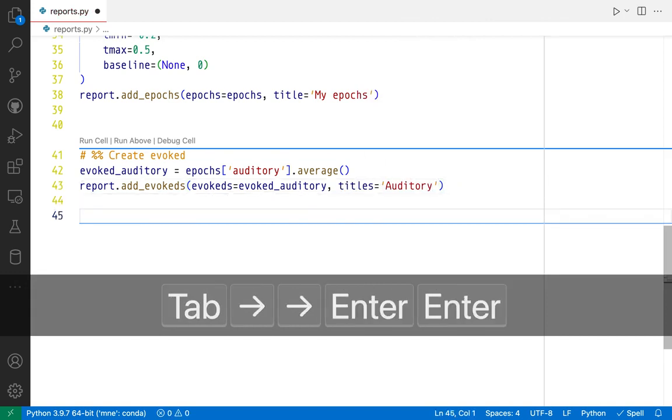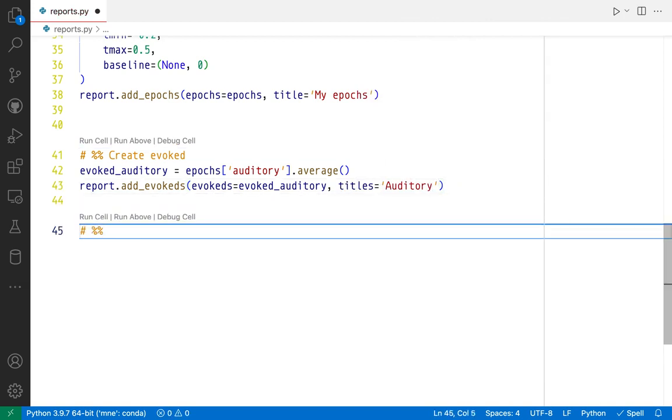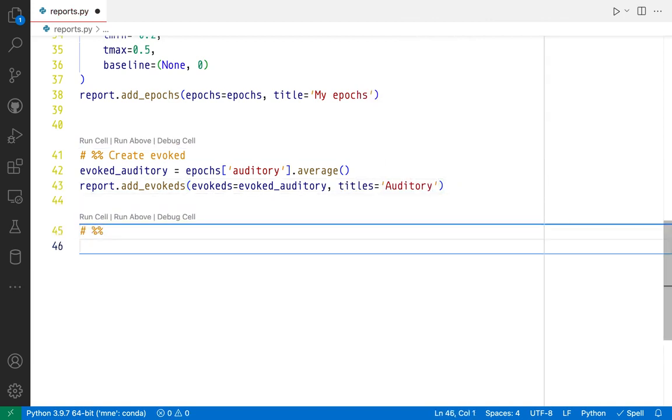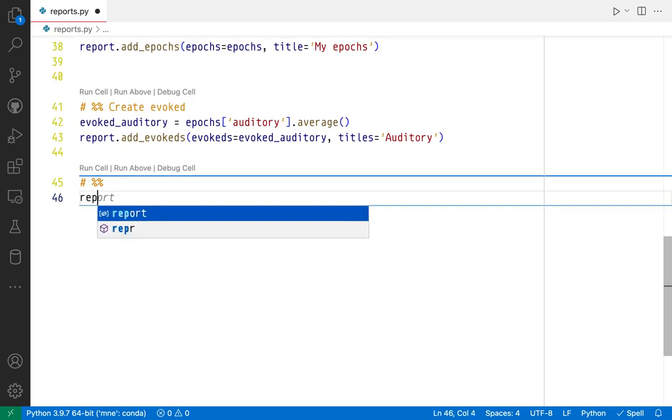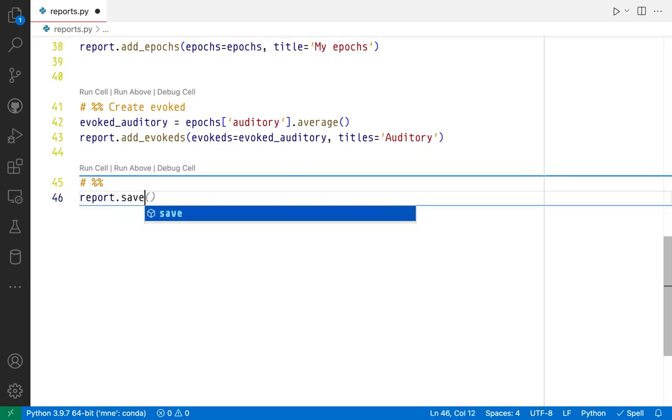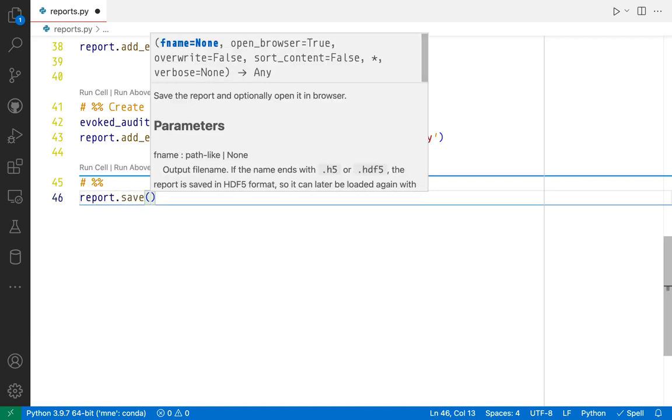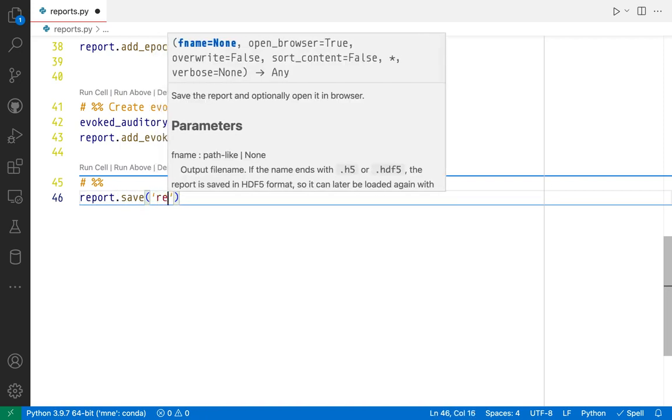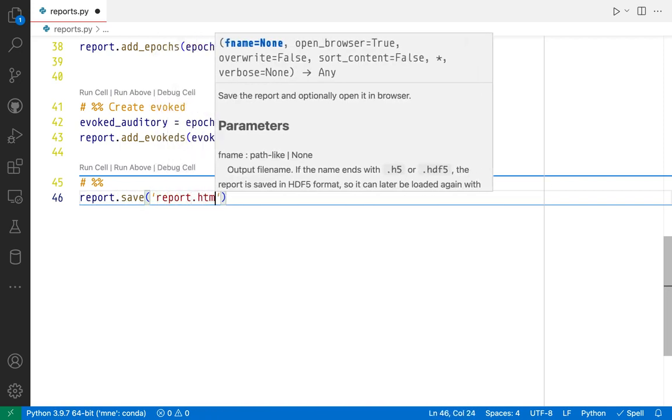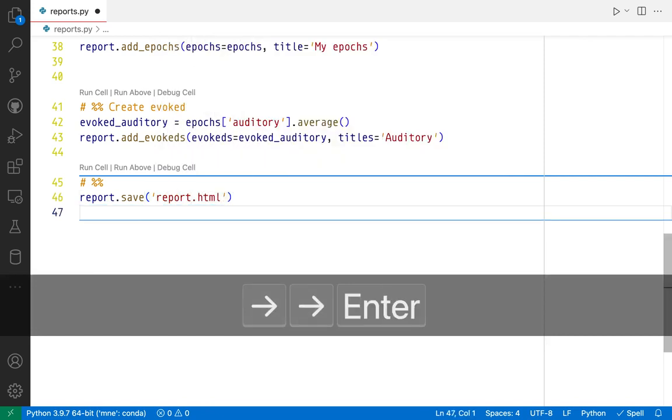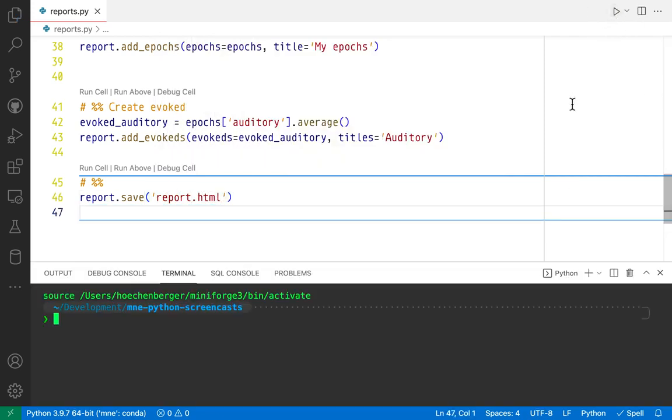We're set. The last thing we need to do now is to actually save the report. And to save it, we're going to call report.save and pass a file name. I'm just going to call it report.html here. I'm going to save the file, run the script.